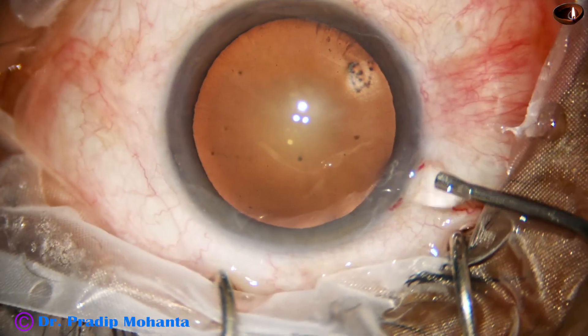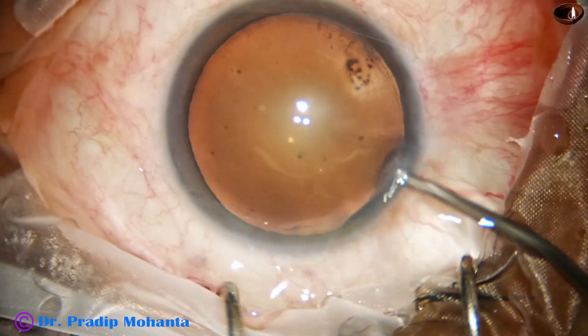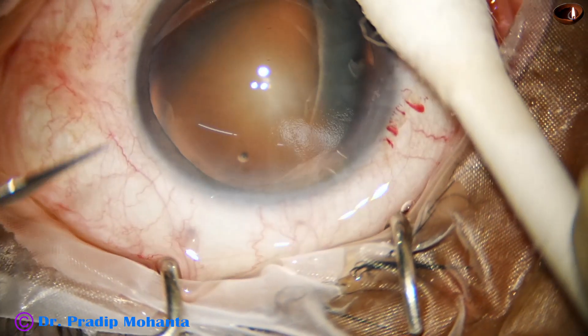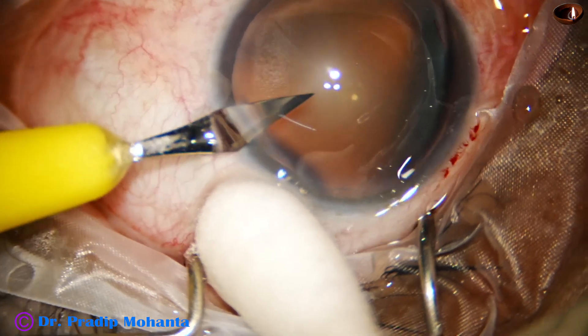The main incision has been made with a 2.8 mm steel keratome. The anterior chamber is filled up with 2% hydroxypropylmethyl cellulose, and now a side port is made on the left side of the main incision, about 3 clock hours away.